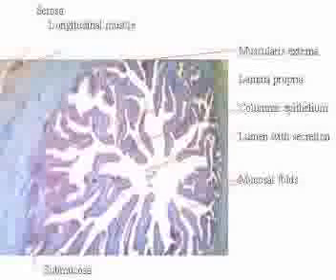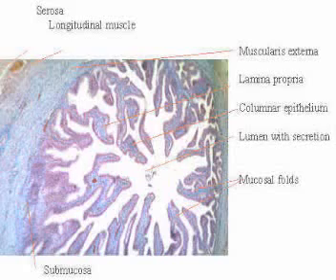Differential diagnosis. The fallopian tube can be confused with any luminal organ such as appendix, trachea or bronchi or small intestine. The small intestine has villi and not mucosal folds. Trachea has pseudostratified epithelium and no columnar cells, and the appendix is devoid of villi or mucosal folds.